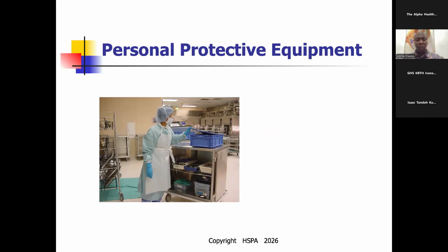This is what we call standard precaution: everything that has come in contact with the patient or is open at the end of use needs to be treated with standard precaution. What does that mean? Wearing your full PPE.